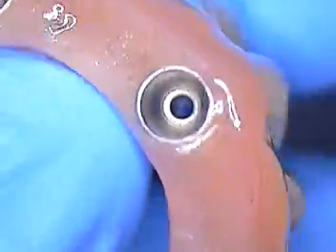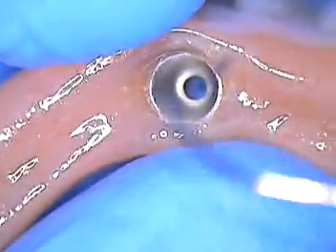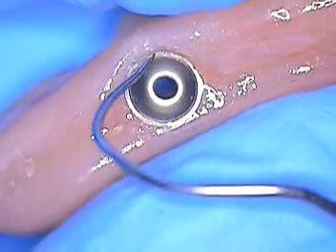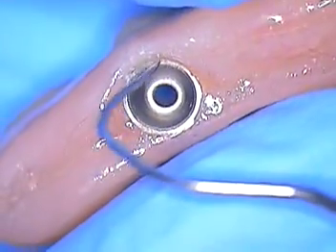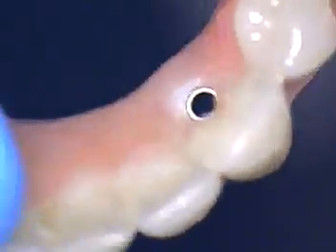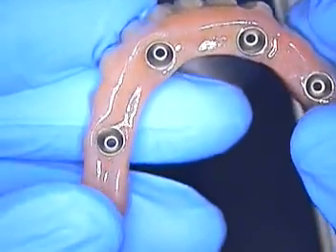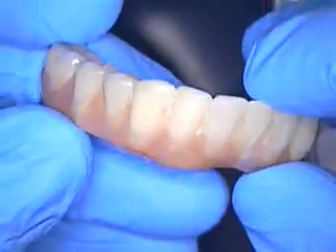How did that happen? Maybe when this was processed, the case may not have been screwed down all the way, leaving a little crack for this material to go into. I'm going to ask my lab if there's an instrument that can be used to clean that — if not, I have to painstakingly do it by hand. Otherwise, this case will not seat properly. There will be a gap space, your screws will come loose over time, and more and more problems will occur. We've got a little work to do before this patient comes in this afternoon.